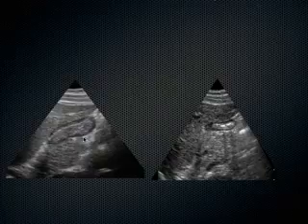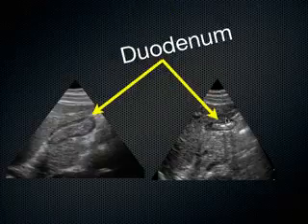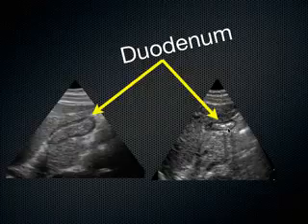Specifically, it's the duodenum. We can see the duodenum sometimes during mid-peristalsis when it's contracted down on itself. When there's air in the duodenum casting shadows, and that duodenum is right next to the gallbladder, it's easy to mistake a normal duodenum for having gallstones, for looking like a WES sign sometimes.